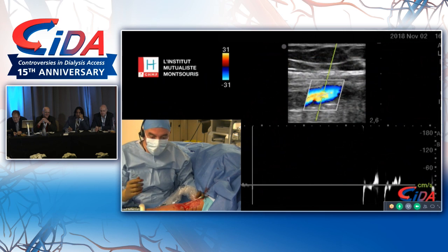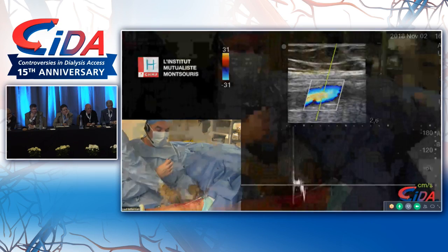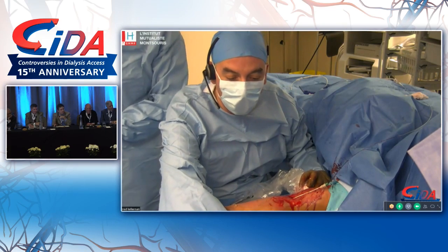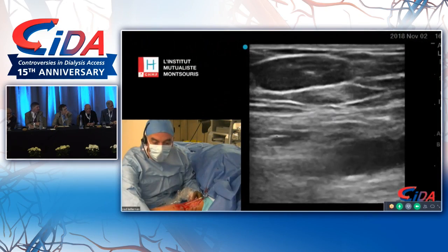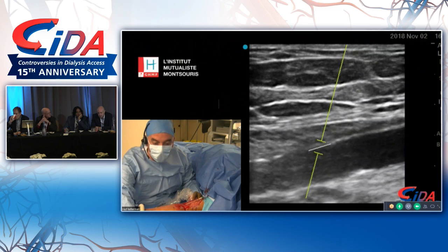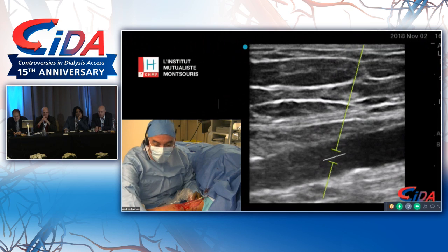So, Alex, we have about a minute or two left before we switch on to other things. Perfect. I'm just going to measure the flow for you while you ask me a question. Any questions from the panel? Rob Jones from Birmingham, UK. Hi, Rob. How are you? Well done. Great case. Thank you, sir. Is the patient under sedation and IV analgesia, or are they completely awake with local anesthetic?